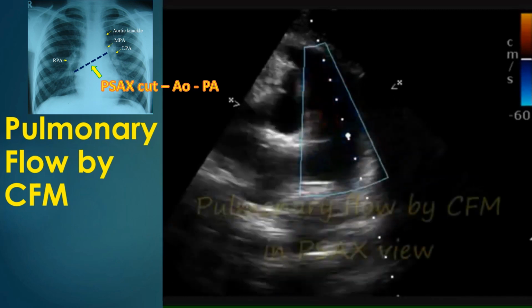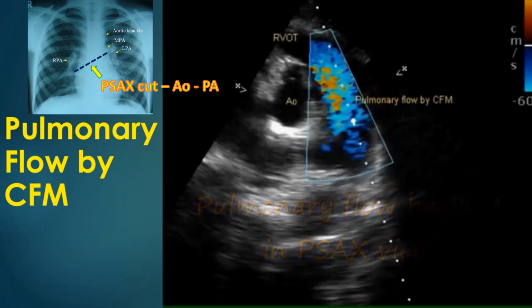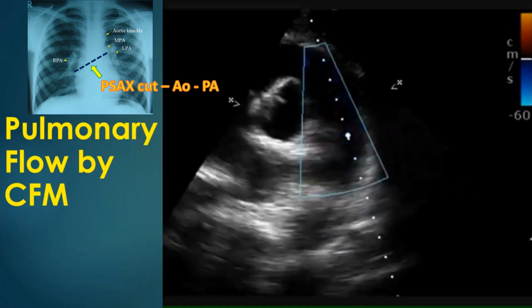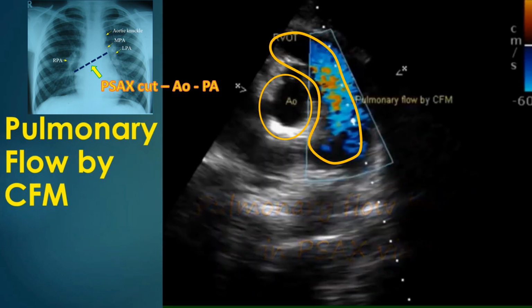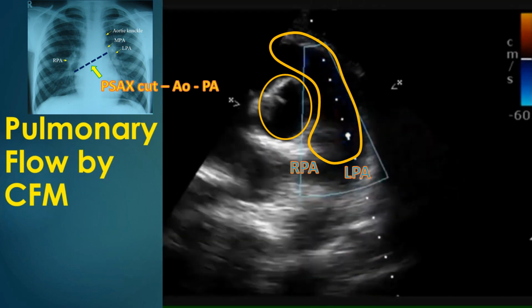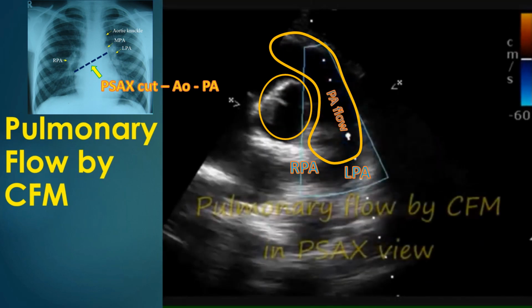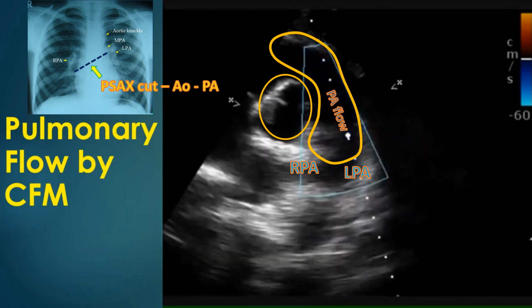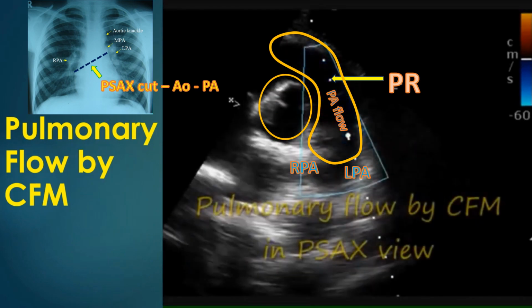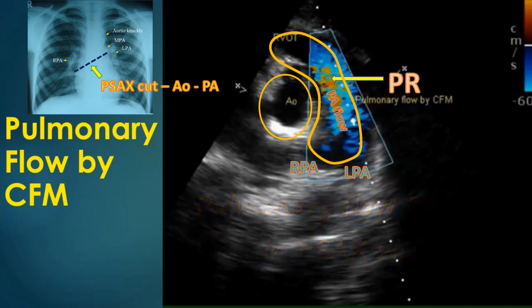Parasternal short-axis view showing right ventricular outflow tract, pulmonary artery and aorta. Right ventricular outflow tract and pulmonary artery are seen curving around the aorta to form the circle and sausage appearance. Pulmonary artery is identified by its bifurcation into left and right pulmonary arteries. Color Doppler shows a blue flow directed away from the transducer. A tiny reverse flow of pulmonary regurgitation can be seen in most individuals. It appears like a tiny flame-like jet directed upwards from the pulmonary valve in the closed position.